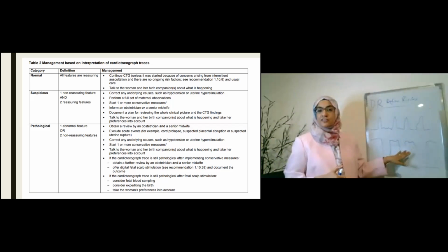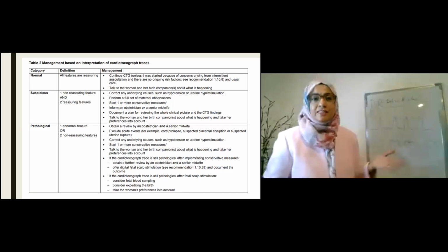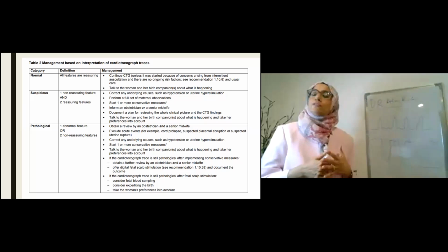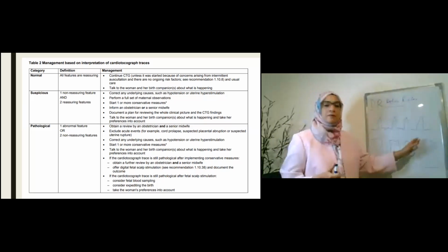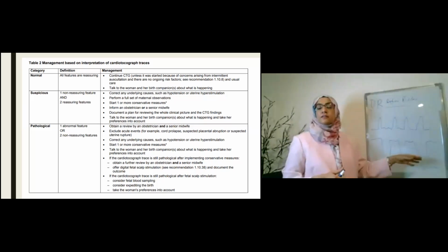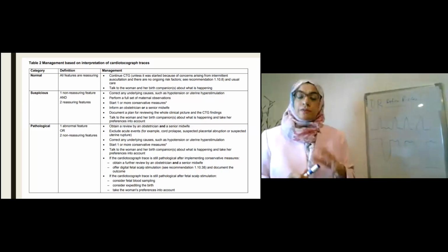But you know what? We do a cesarean section, we do a difficult forceps, baby comes out fine, and the gases were also fine. And don't ask me to describe how did that happen. Some babies have got amazing reserve. So they are keeping themselves good, and you deliver them and they're absolutely fine. So over here, you can say that this is not 100%. Okay. Then you talk about the person reading it.